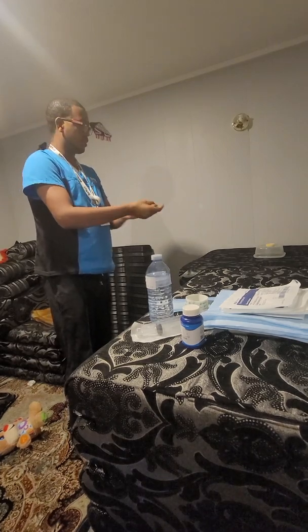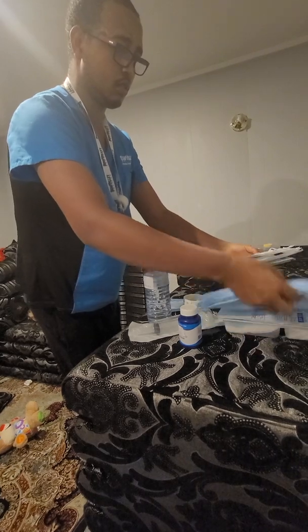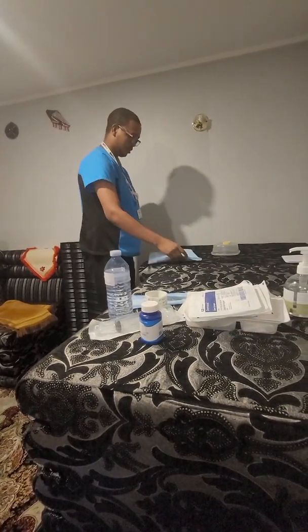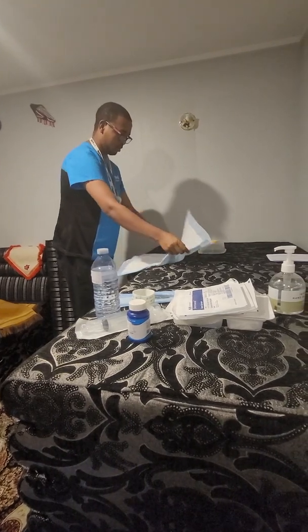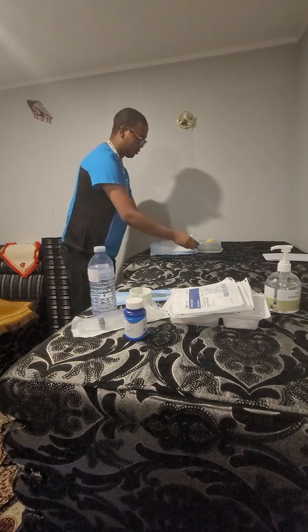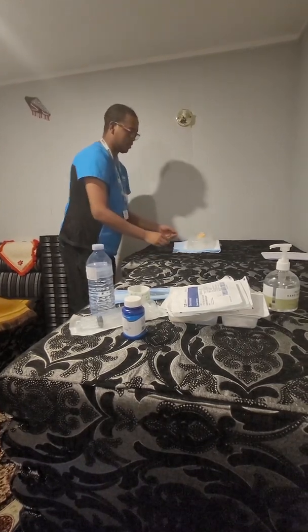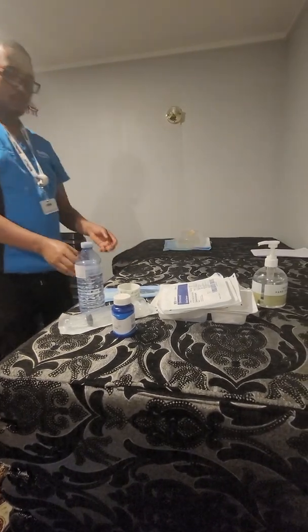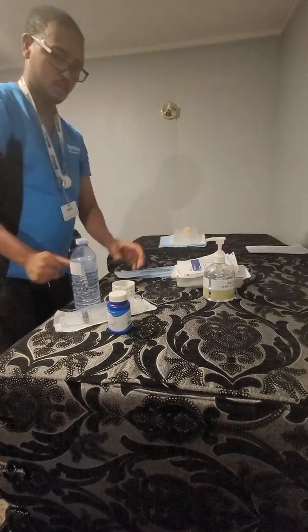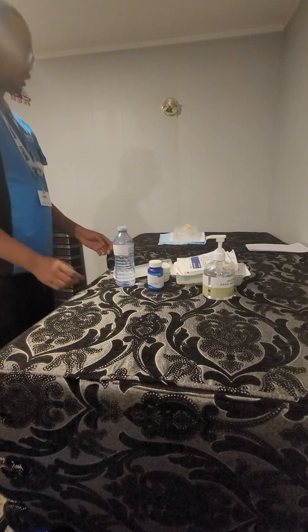And then I'll just put a blue pad under my patient to catch the drainage. I'm going to tilt it to make it rinse down with gravity.